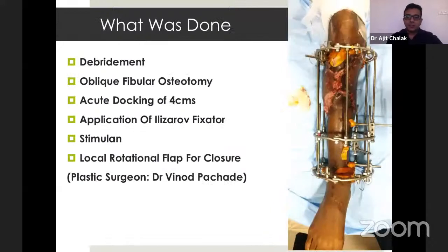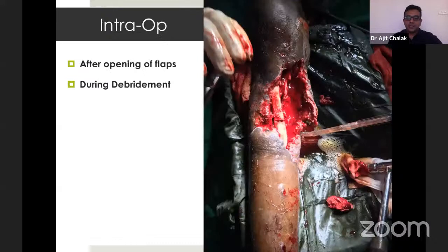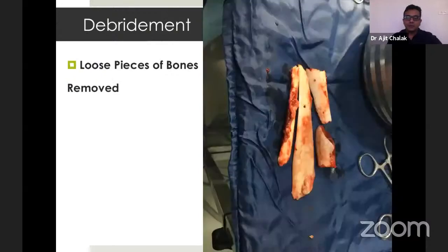The surgery offered included debridement, oblique fibular osteotomy for acute docking of around 4 cm, application of the Ilizarov ring fixator, Stimulan loaded with gentamicin and tobramycin, and a local rotational flap for closure done by a plastic surgeon. These are intraoperative pictures after opening the flap and during the debridement. These were the loose pieces of bone removed after debridement, which were devoid of any soft tissue attachment.